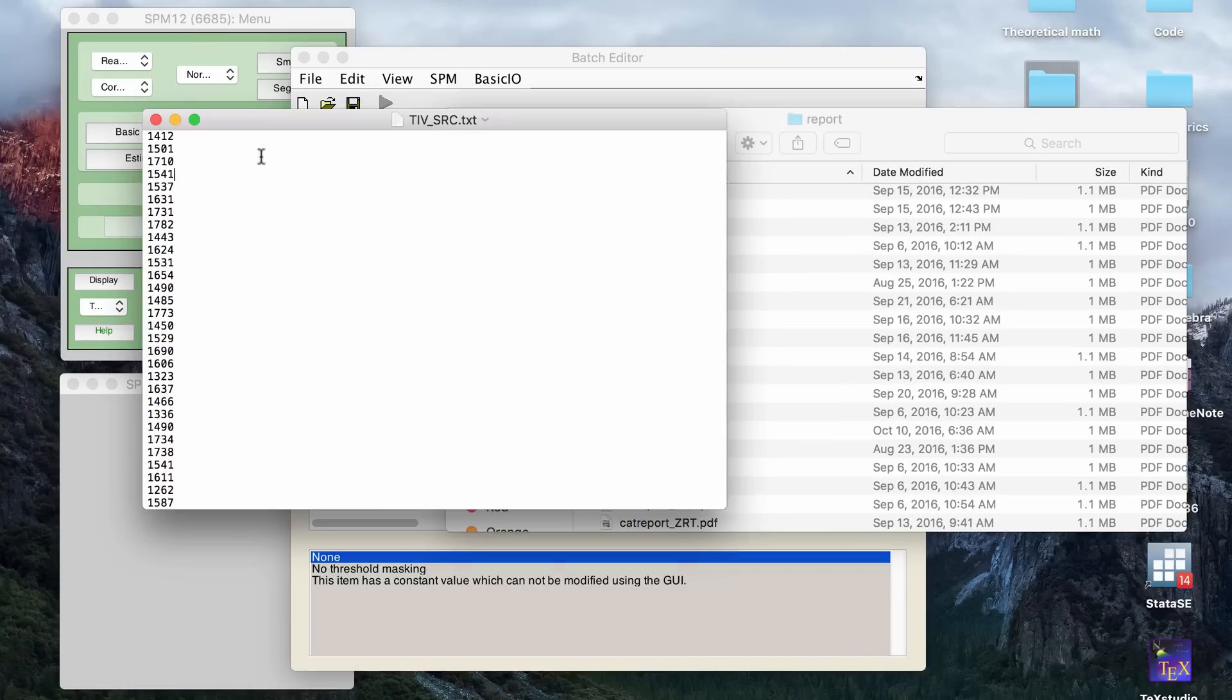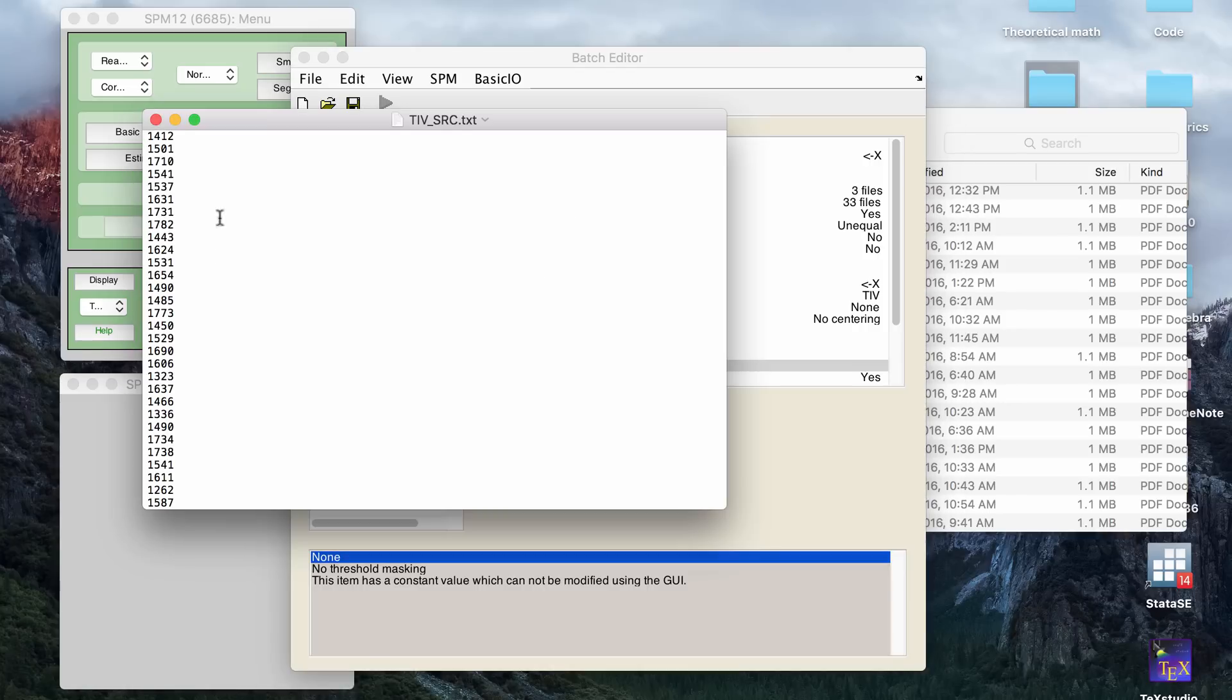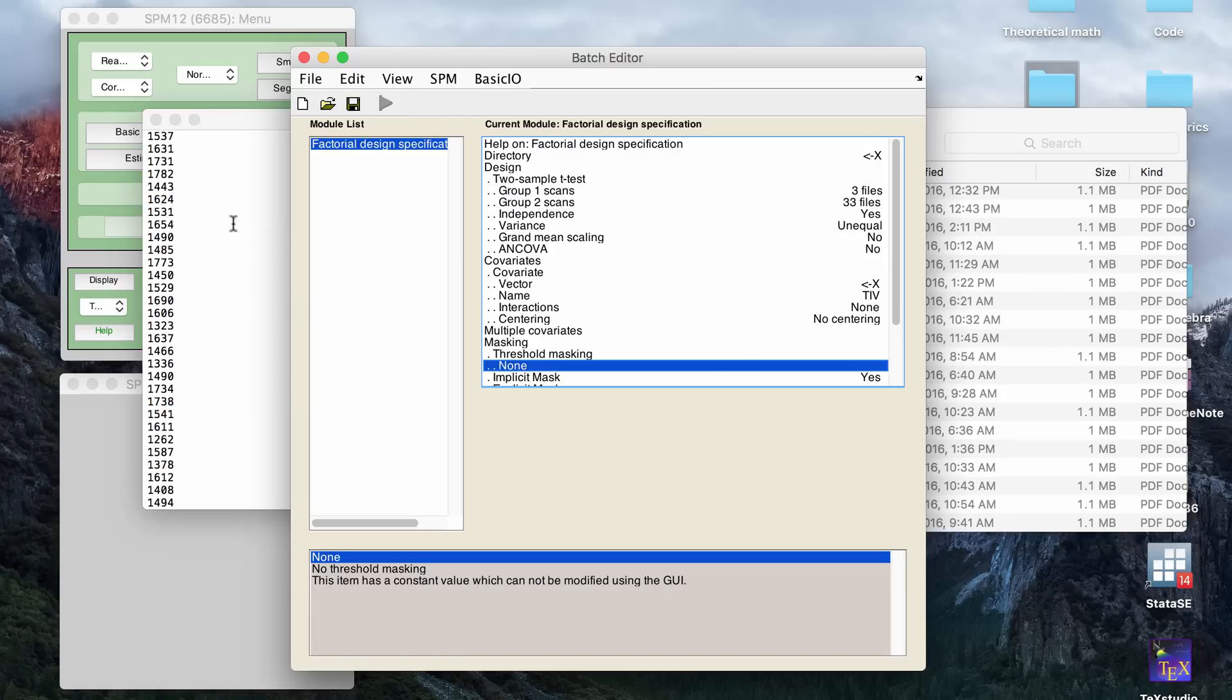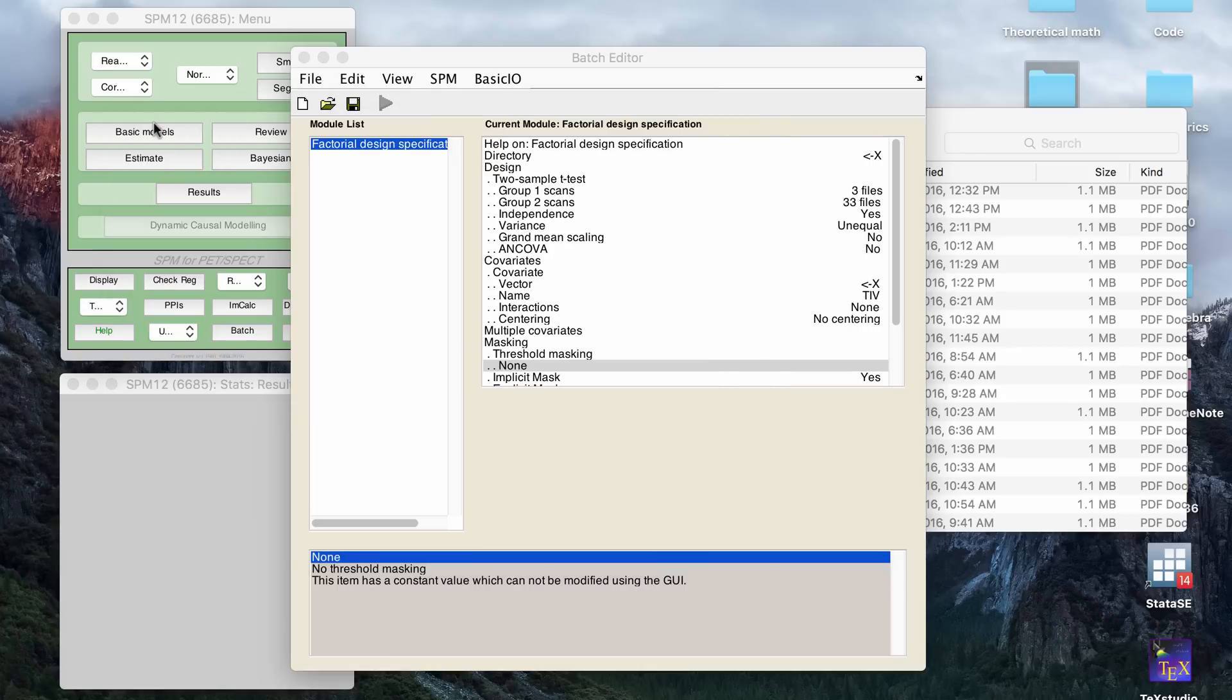And you just want to make sure you write a text file where you're sure that the inputs of your files are the same order as your text file. So you want to make sure the covariate data is matching up to each file correctly. And the way I do that is just by making sure all my file names have the initials of the patients first. And so that will be put in alphabetical order. So I can be sure that each time I do it, I'm also creating a file with alphabetical order, if that makes sense.